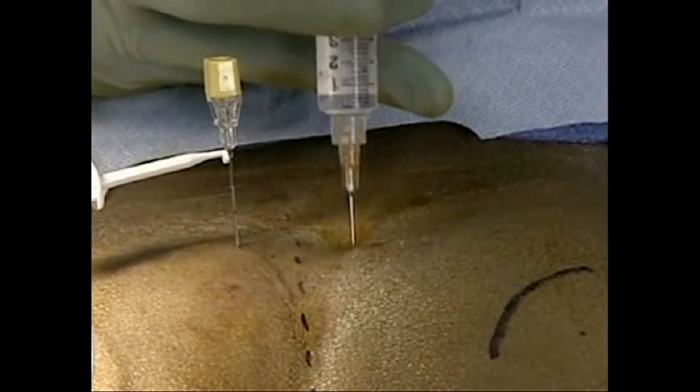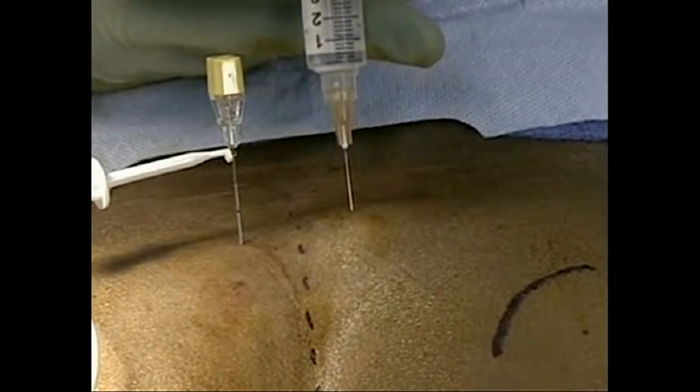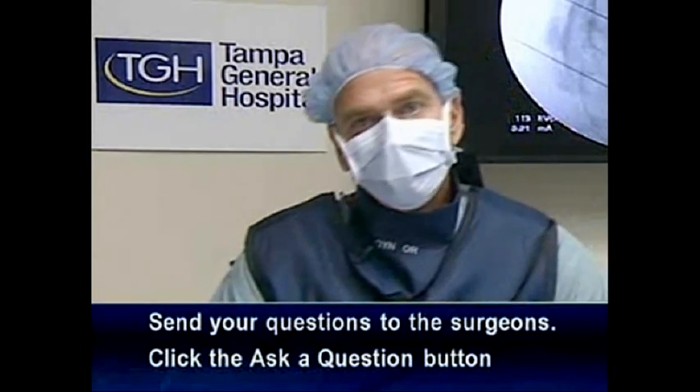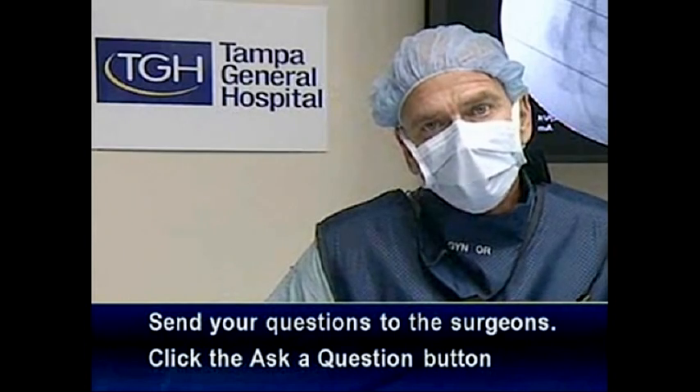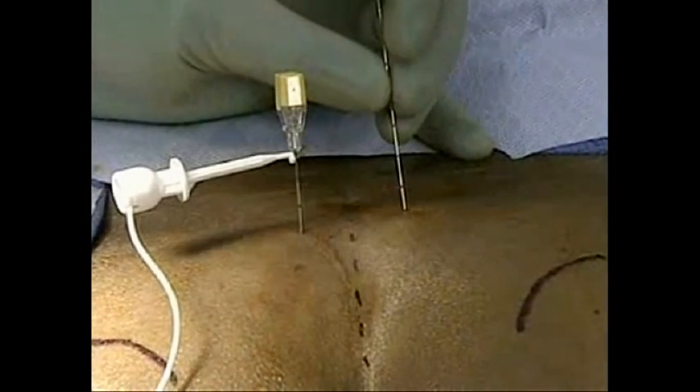While he's doing the numbing, I'd like to invite any more questions. We have a question about whether alcohol or medication affects the device. Alcohol does have an effect on bladder function, as do many medications. It's important to talk to your urologist and give him that information — whether you drink a moderate to severe amount of alcohol or if you're on any medications — so he can make the best choices for your therapy.